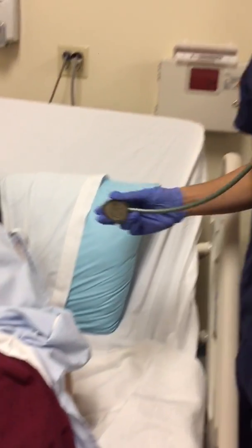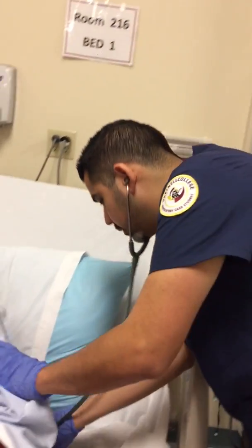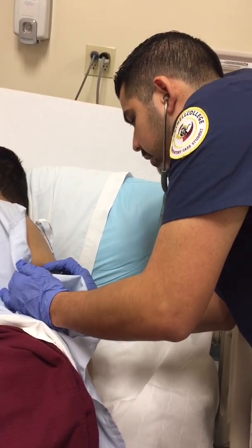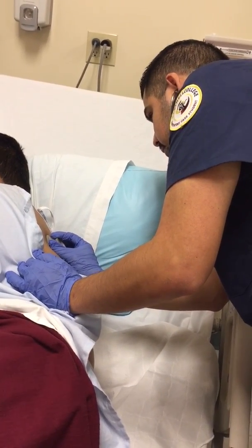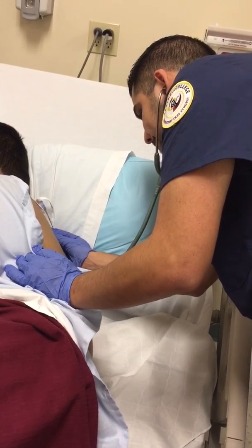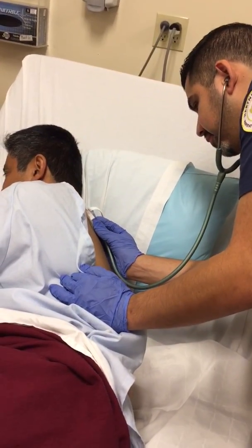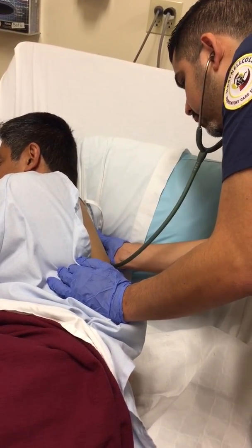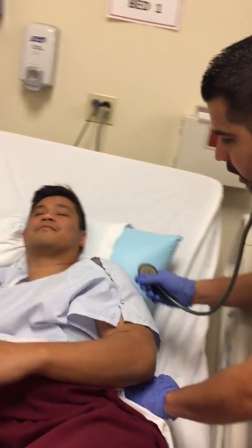And again, to listen to the lungs, you do a systematic approach. Start from one side, you go to the other, and then you go up like this, kind of like a ladder. All right, so go ahead, take a deep breath for me. Thank you. All right, very good. Thank you. I'm going to roll over here to the side. I'm going to listen to the front, okay?